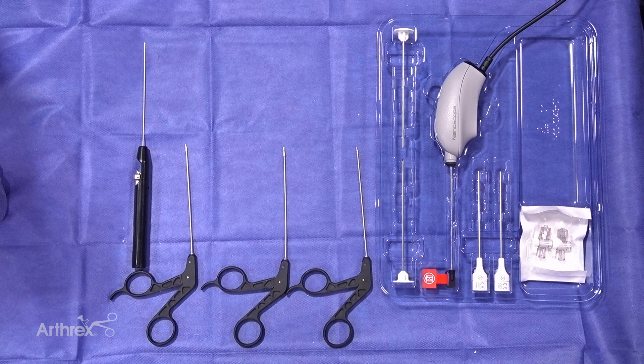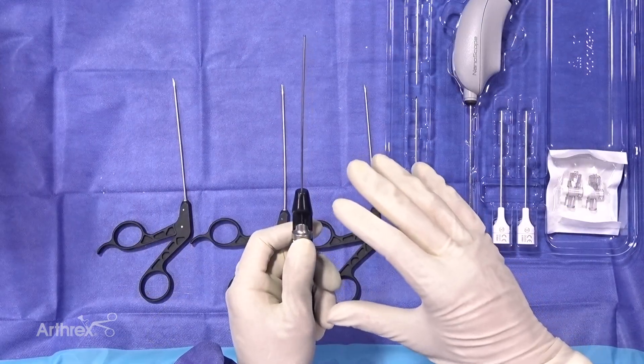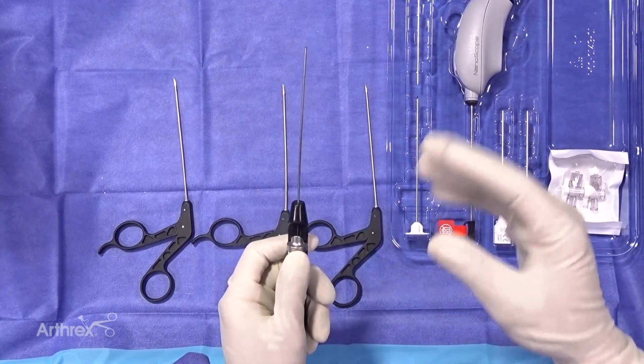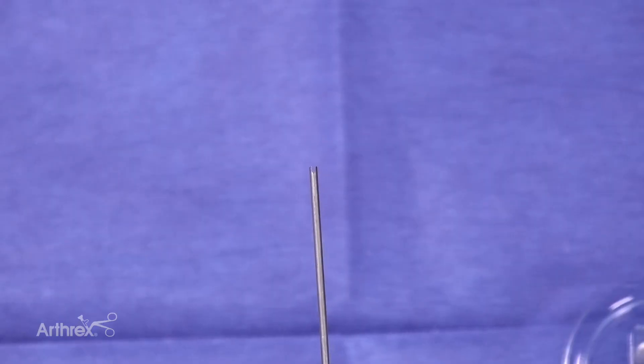There's a lot of things you can do in a sterile peel pack, but what makes the nanoscope special is that with some initial tools — a punch, a grasper, scissors, and a nitinol probe — you're well equipped. With standard wrist arthroscopy, when you insert a standard metal probe which is at least four millimeters, you get hooked up on tissue during insertion. But a smooth cannula allows you to insert easily, and then you can deploy the nitinol probe which is two millimeters.